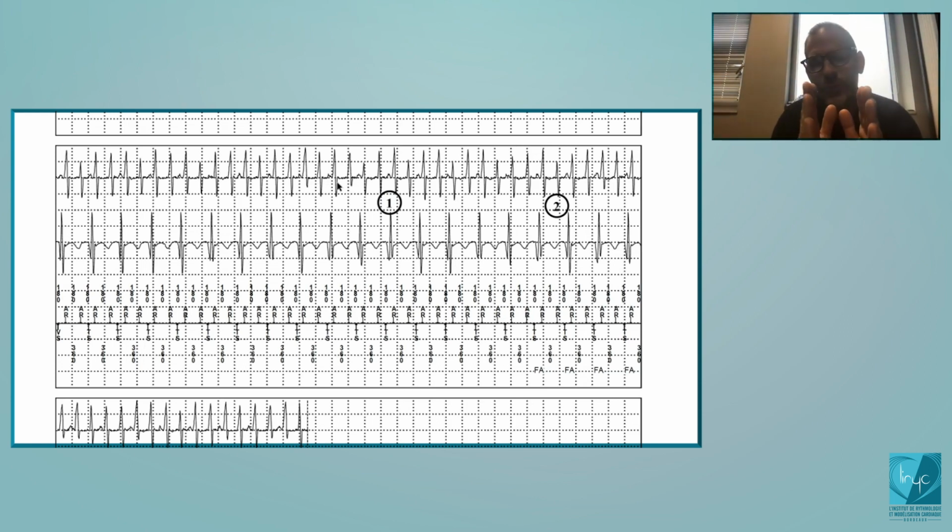And you need to have one sensing at the level of the atrial channel which is very close to the ventricular signals also. So if there is a repetition of sequences, long, short, with one of the cycles detected just before or just after the ventricle, there will be a suspicion of oversensing.